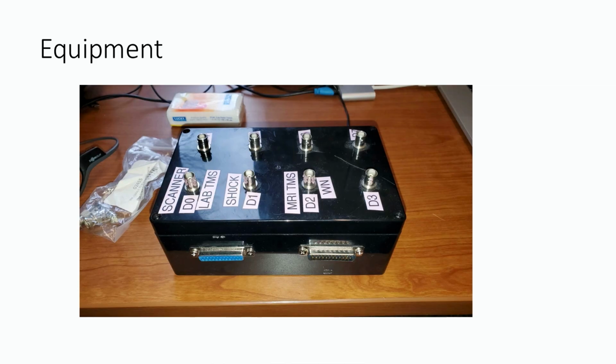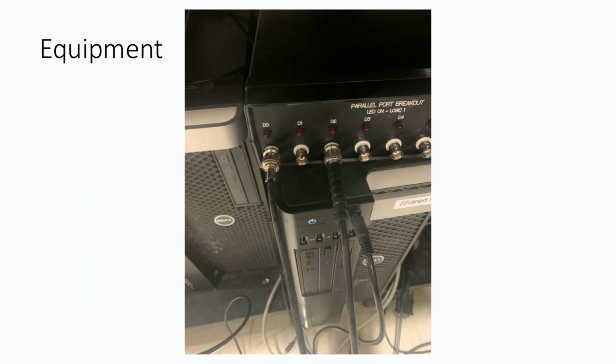We have an independent computer sending triggers for the scan acquisition, volume by volume, and also triggering the TMS box. So that gives you a lot of control over timing. So you have this DB25. Each pin is kind of devoted to a different piece of hardware. It has an independent pin for each piece of hardware that you want to independently trigger. Yeah, that's what it looks like from another view.